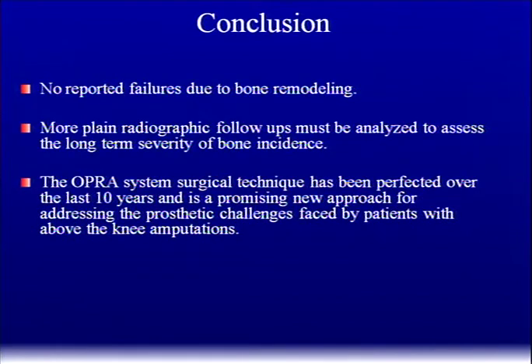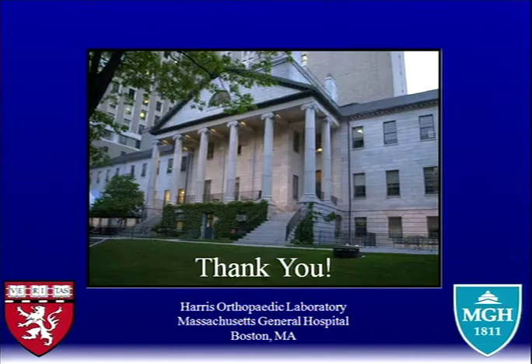There have been no reported failures due to this bone remodeling around these implants. Certainly more plain radiographic follow-up is needed to analyze and assess the long-term severity of this bone loss. The OPRA system is a surgical technique that has been perfected over the last 10 years as a promising new approach for addressing prosthetic challenges faced by these patients with above-the-knee amputations. Thank you.